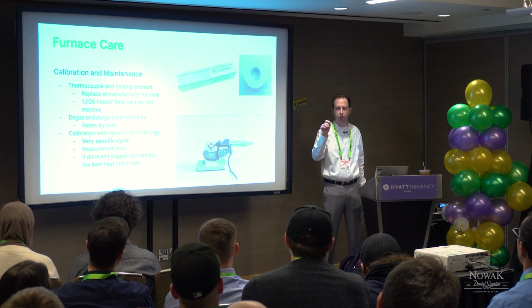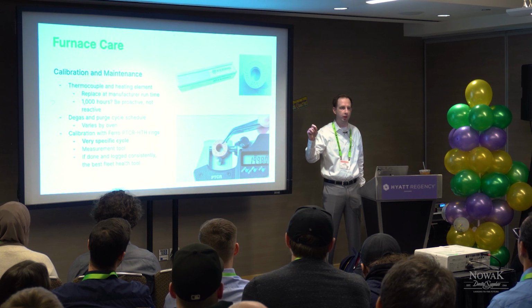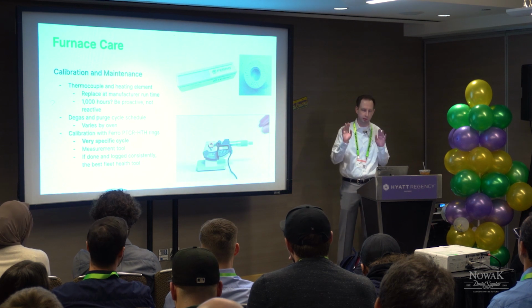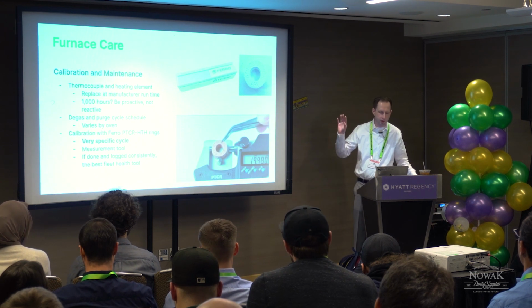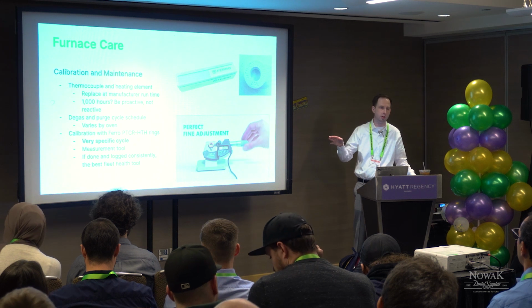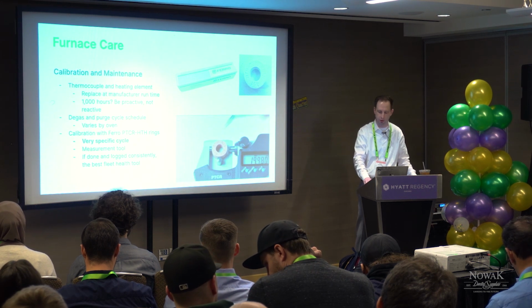You can see, oh, this one was doing really good, and all of a sudden it's dipping down. Let's check the elements, let's do something. This is all about being proactive in sintering. Zirconia, like everything else, is secondary to sintering. If you've got bad sintering, it's just setting you up for a bad time. This is a way to really control a fleet of sintering furnaces, especially if you have lots of different types of furnaces. 1500 C is 1500 C. I don't care what kind of furnace it is, and don't overload your furnaces.